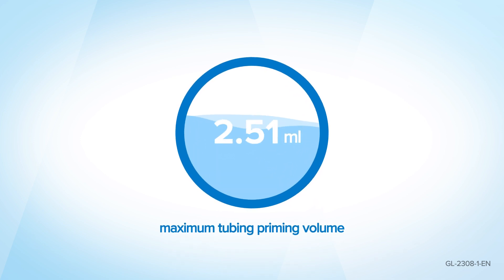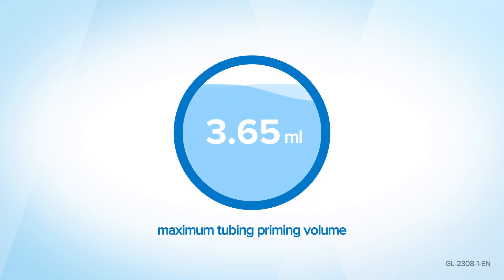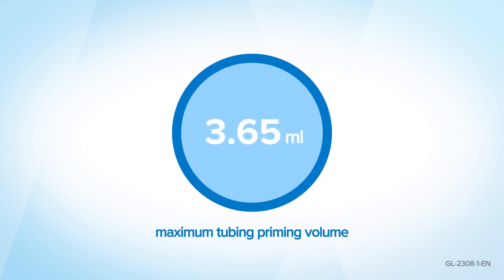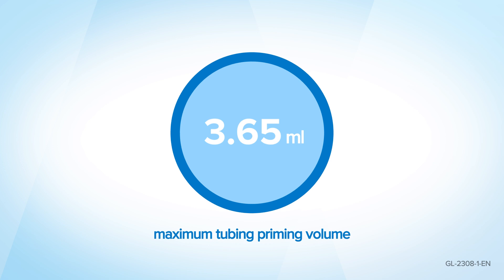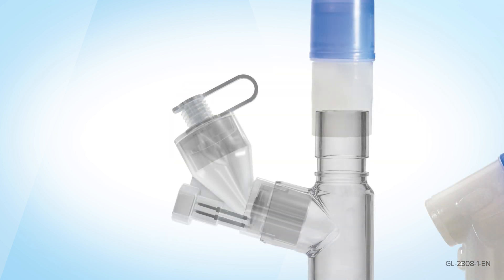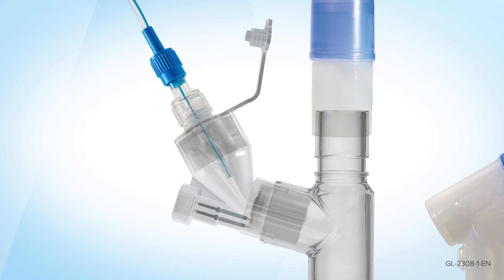Ensure proper orientation of the Aerogen Solo as it is gravity fed. Open the plug on the Aerogen Solo — do not remove the plug. Screw the blue CNTS tubing connector onto the top of the Aerogen Solo.